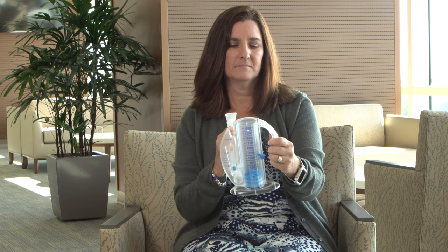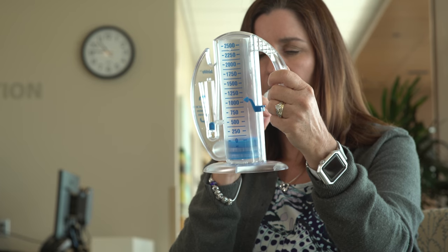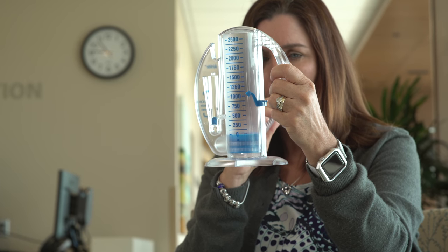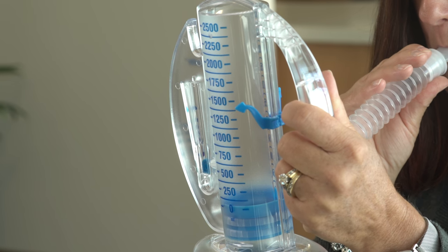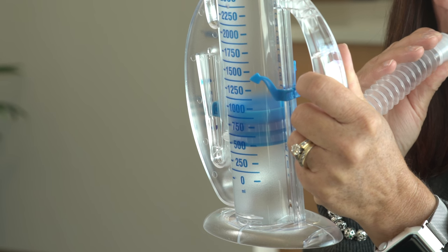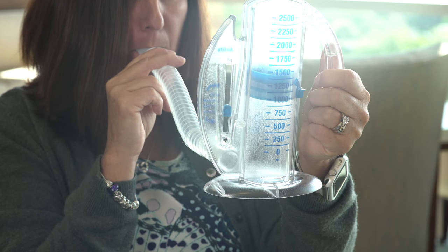Slowly position yourself in an upright, seated position. Place the mouthpiece in your mouth and seal your lips tightly around it. Breathe in slowly and as deeply as possible. Notice the piston rising toward the top of the column. The indicator will rise and should remain between the two arrows.